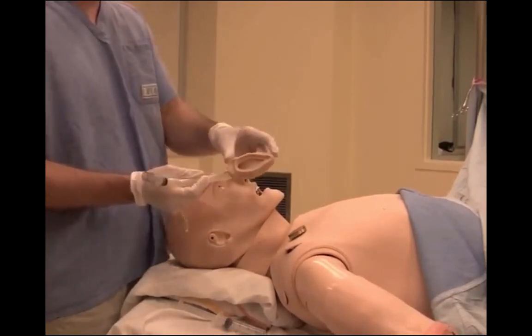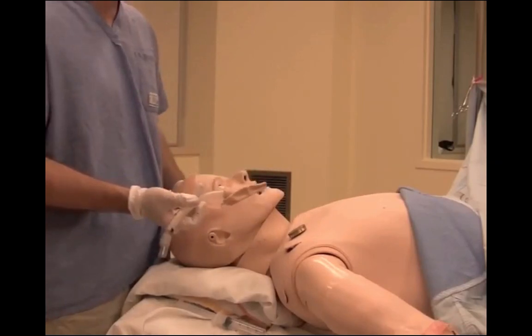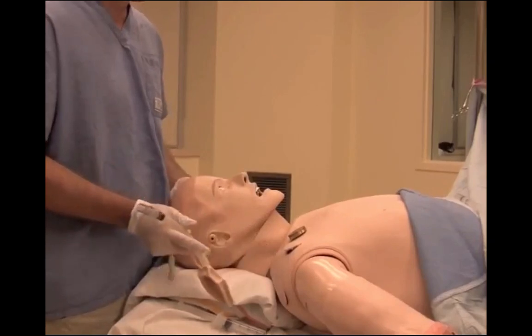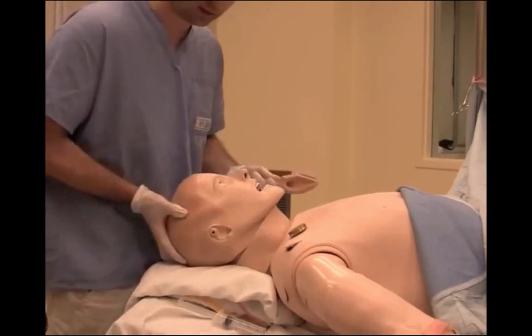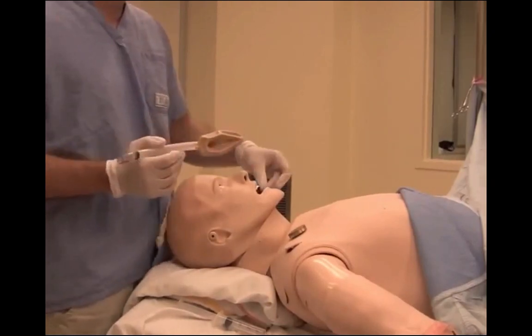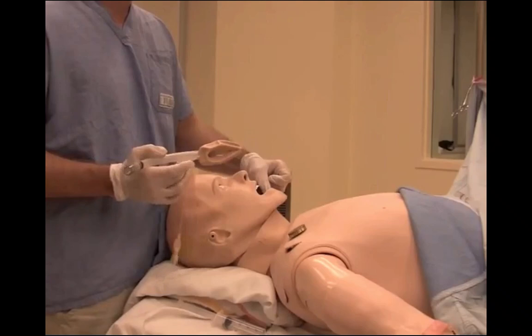The cuff for the LMA is significantly larger than the endotracheal tube, and thus, to insert it through the mouth requires a wide open mouth. To do this, extension of the head by placing the right hand under the occiput will naturally open the mouth. The mouth can also be opened with a scissor technique, with your thumb and middle finger of your left hand.